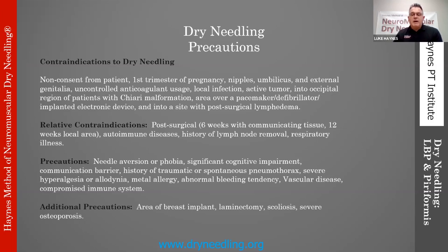especially in the spine issues, someone who's undergone a laminectomy or who has scoliosis or severe osteoporosis. That can have a significant impact when we're talking about our backdrop, which typically will be on the lamina of the spine itself. And obviously, if there's been a laminectomy, all of a sudden that backdrop is not there, or if there's scoliosis and you have a rotation of the vertebra, then your elevation and your height or your depth of penetration will vary, and it can be fairly significant based on the curvature and the rotation of the vertebra in that regard.